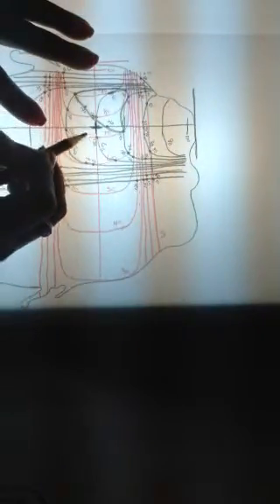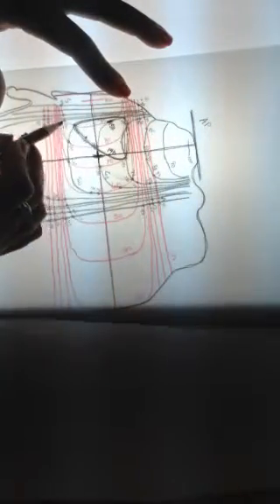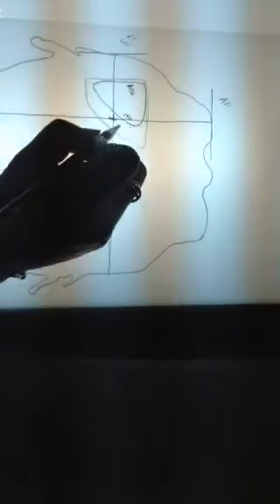So as I continue and find out where the 130% isodose points connect, once I determine that, then I can use my overlay again. Remember to line up your isodose, line up your central axes and your contour, and then I could sketch out where the 130% isodose lines would come. I already know that they're going to come somewhere like this because of the beam arrangement that I've chosen. An AP and a right lateral separated by 90 degrees will give you an isodose distribution that would look something like this.